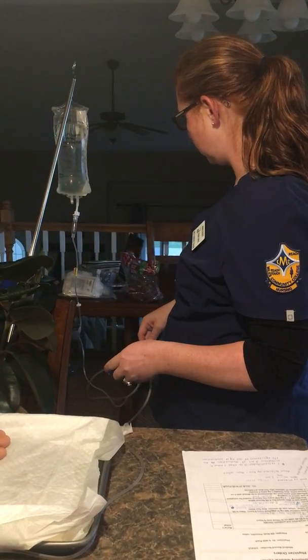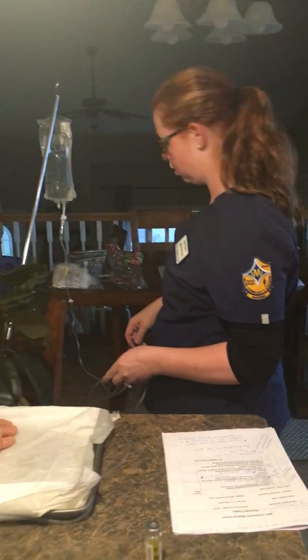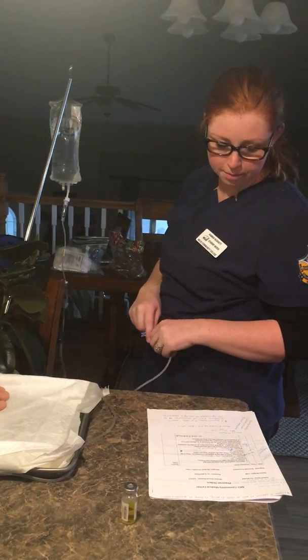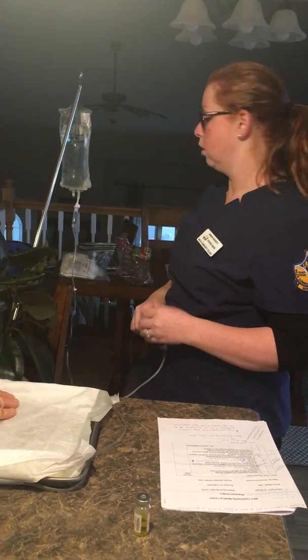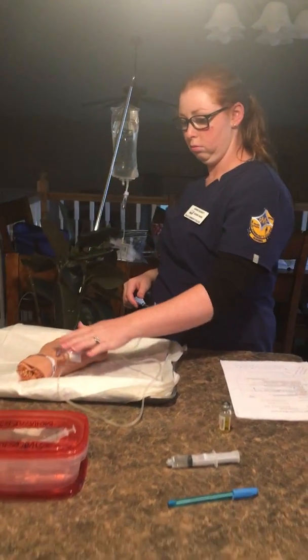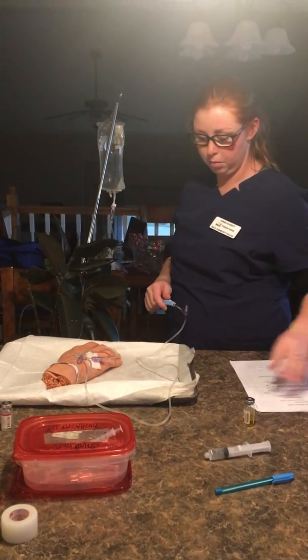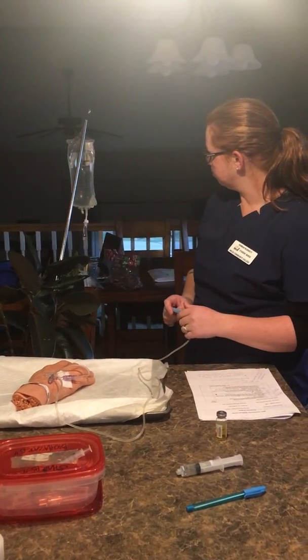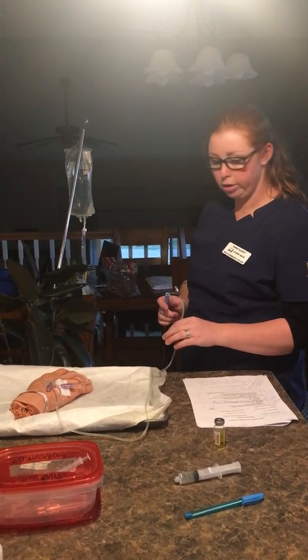Once we've got that set back up, again I would time it using a timer — for the sake of the video I won't do that again. And again, make sure that you are all good here, making sure you don't have any infiltration or anything like that. And you should be good to go.